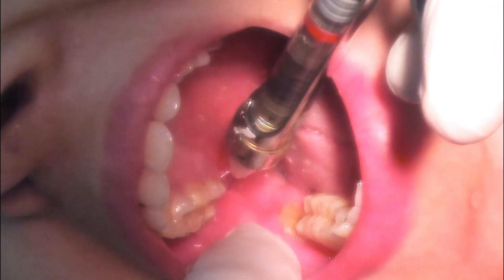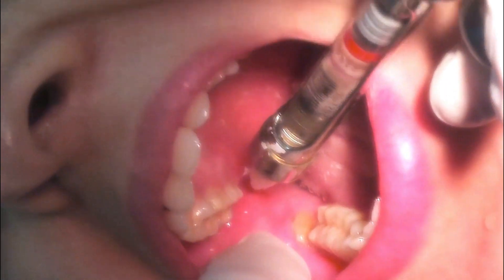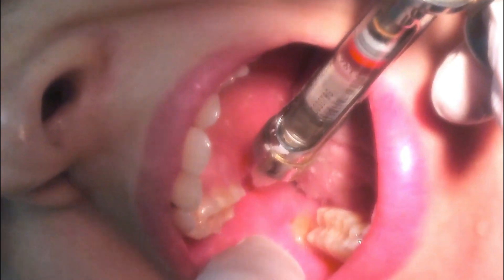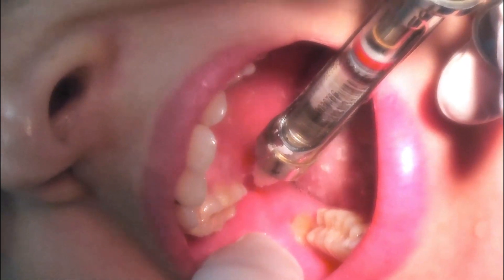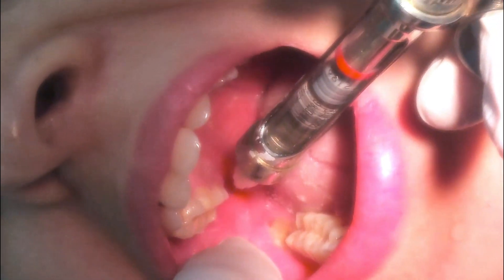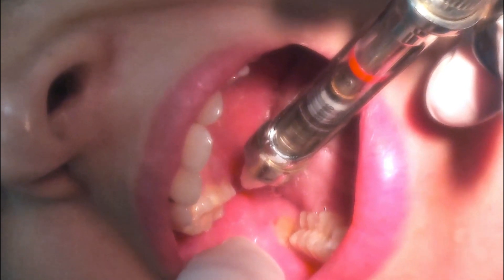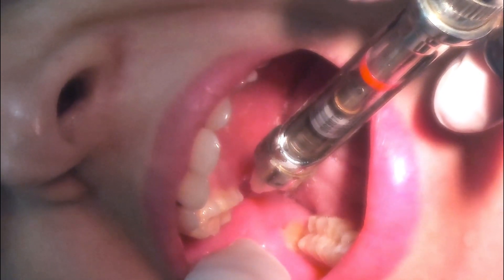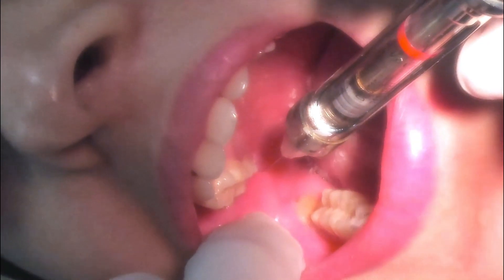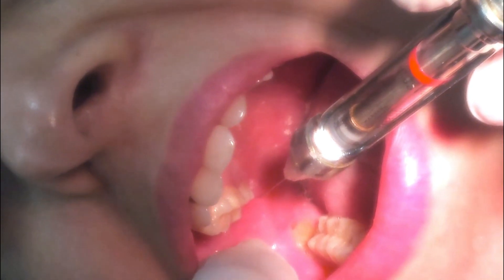I usually start with a highly placed inferior alveolar nerve block. You need to hit bone, aspirate, and deposit about 1.5 ml of lignocaine with adrenaline 1 in 1 lakh. I then take the needle slightly out to give the lingual nerve block and also supplement this with the long buccal nerve block.